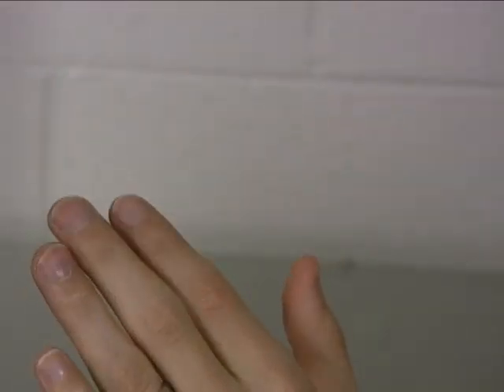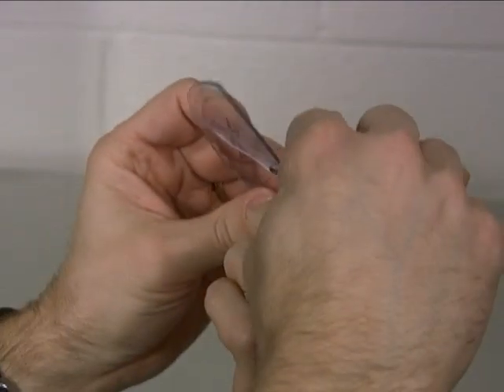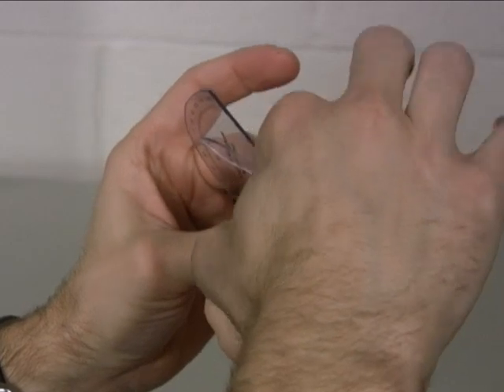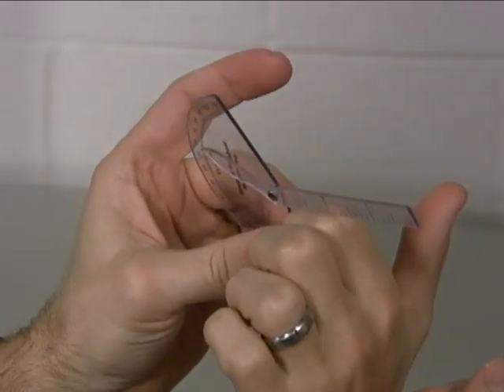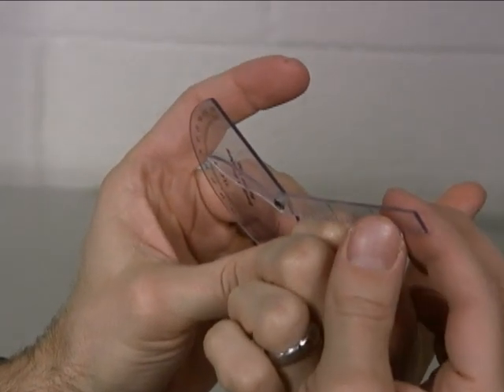Then go ahead and make a hook fist like this again, and measure that nice and tight. Very good.